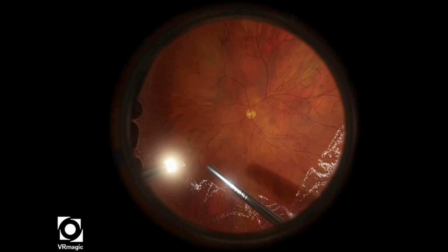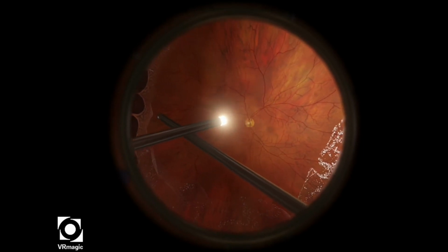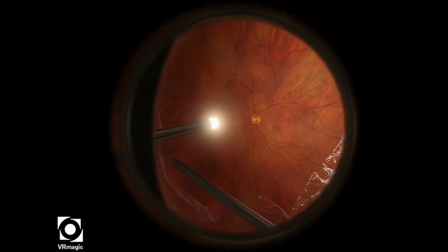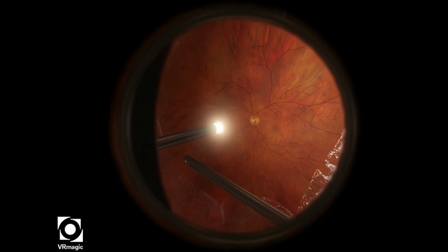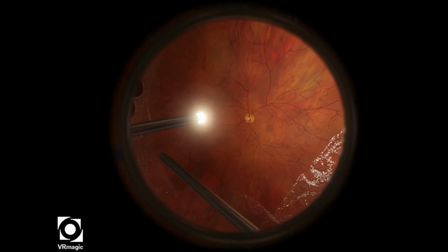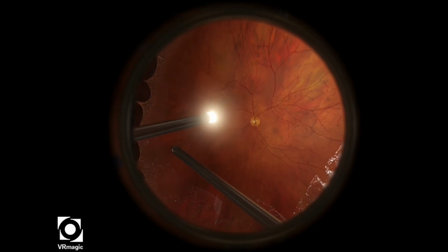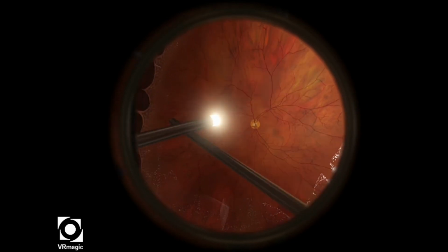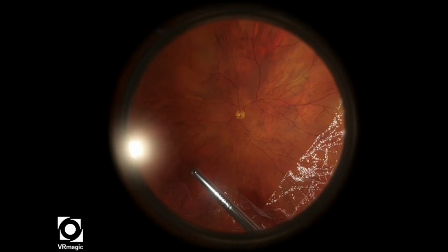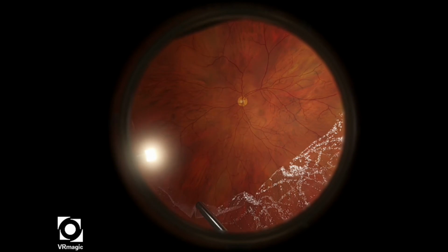So lift, and then cut away. I'm trying to use whatever light can bounce off the retina to cut the remaining vitreous. It is a little bit challenging as I don't want my light pipe to slip. In real life, you would be able to depress using the light pipe and take away some of that peripheral vitreous, but in this particular case the simulator is not able to emulate that at all. So I've gently cut as much as I can, again trying my best not to induce any tears at this particular point.